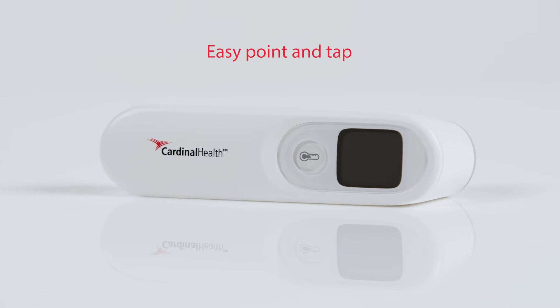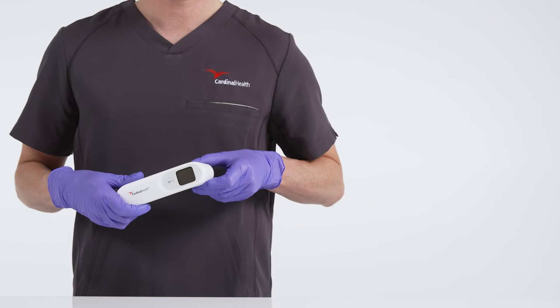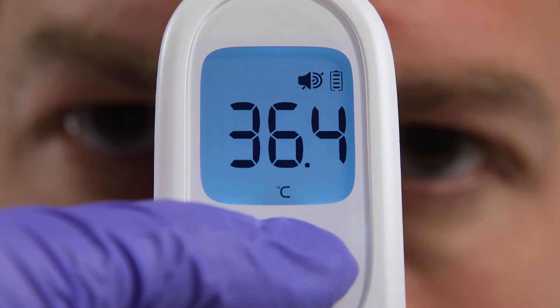And easy to use because the NCIT is compact and lightweight. With no other components or accessories, providers can simply point and tap the Take Temperature button for a reading.